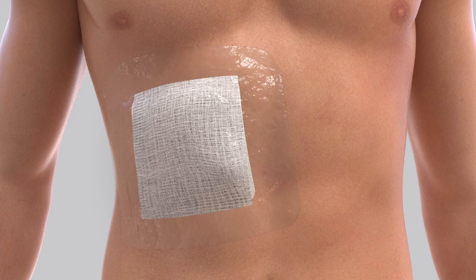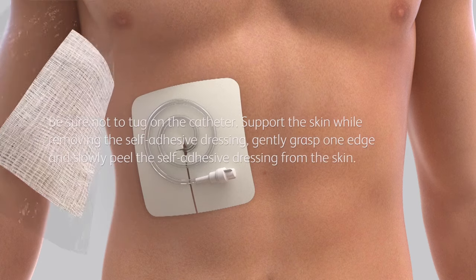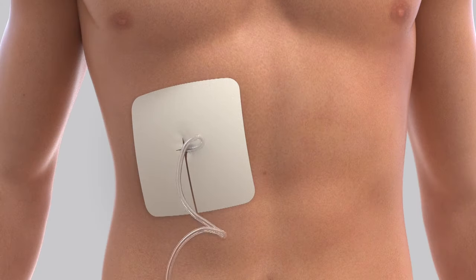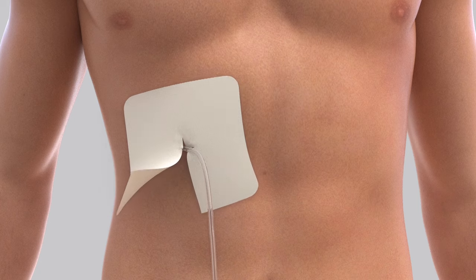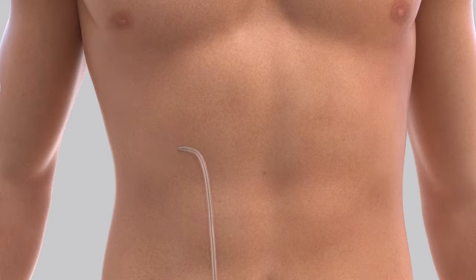Remove the dressing from the area around the catheter and discard it. Be sure not to tug on the catheter. Support the skin while removing the self-adhesive dressing. Gently grasp one edge and slowly peel the self-adhesive dressing from the skin. If you notice any redness or swelling around the catheter, any fluid leaking, or if the white cuff is visible on the outside of your body, continue the drainage procedure and then call your doctor or nurse to report what you see.